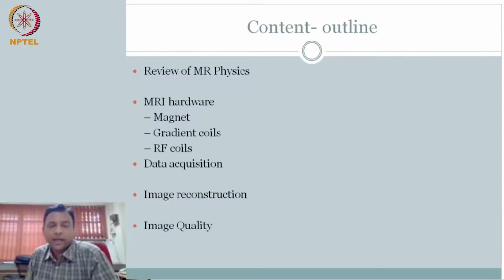Okay, so I guess you had a chance to view and appreciate the beauty of MRI recording, right? The data that we got, and why is it that the data that you are recording, unlike other modalities, here what you're recording is actually the Fourier transform. Even though the signal is represented as S of t, the data that you're recording actually turns out to be samples of your Fourier spectra.